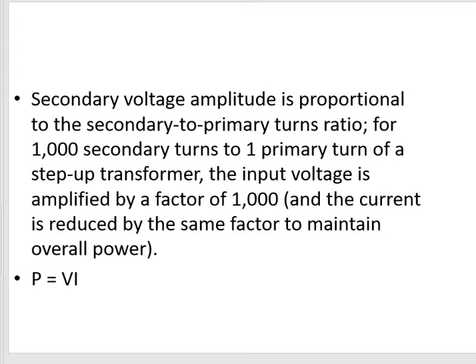And for this reason, power supply does two things. First, they use a step-up transformer to maximize the voltage, and then when the power supply has reached a residential neighborhood or area or industry, they use a step-down transformer to reduce the voltage to a usable power point for distribution.